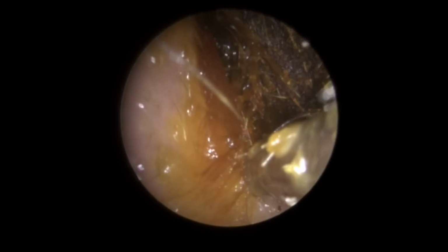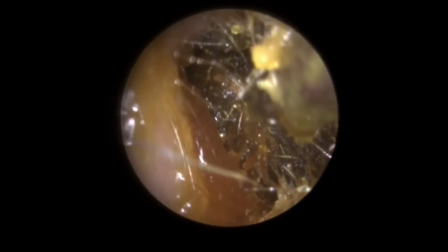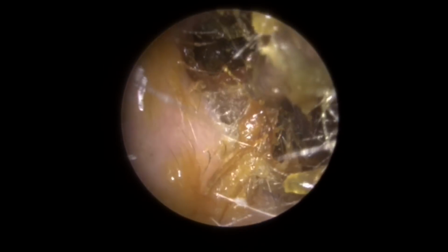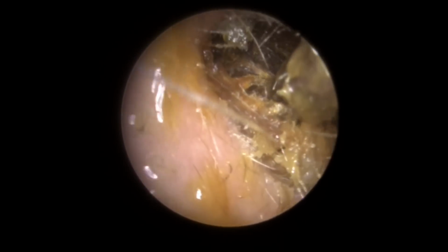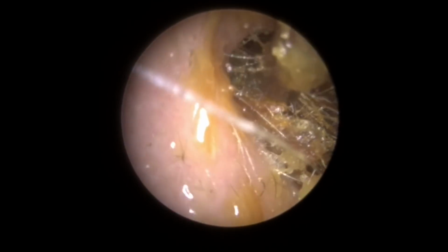So use the Jobson horn now just to break this front end of wax down. There we are, so that's come away. You can see this very dark, deep section of wax. Lifting now, as we push the Jobson horn down to bring this out, you can see it's actually squashed some of the wax against the canal wall. So we do need to try and unstick that now before we can go any further. There you go. So lifting that bottom section, taking that away is going to add a little bit of maneuverability to the wax. Means we can lift it up and down, move it left to right, just to try and unstick things.